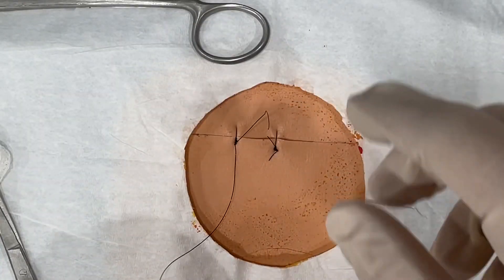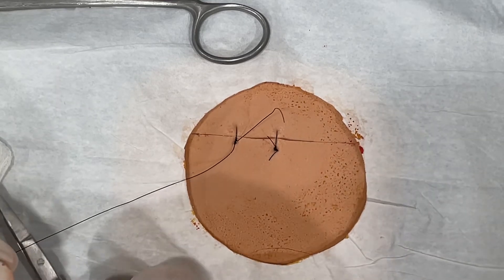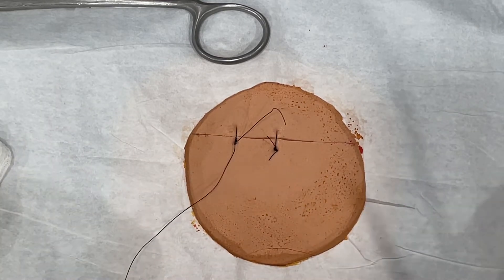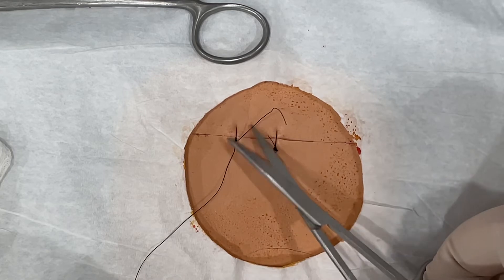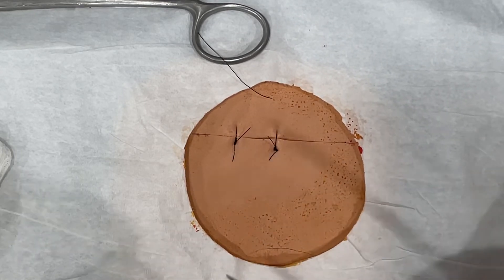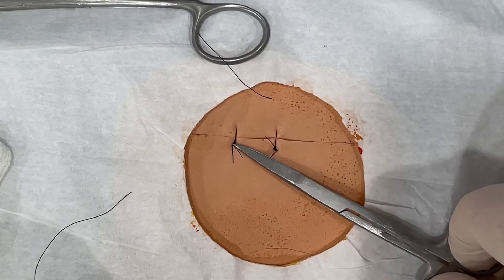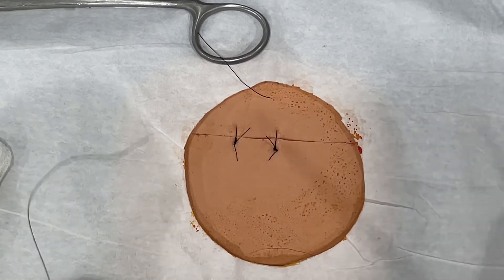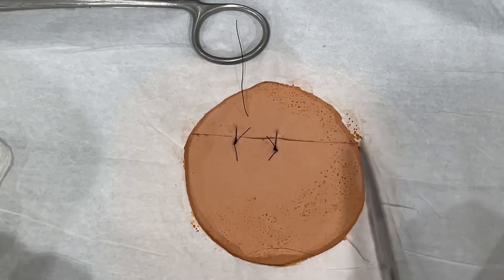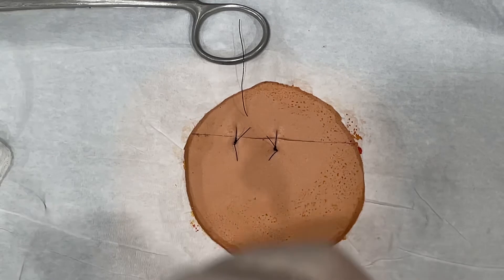What you want to do with the tightness of your suture — you don't want to strangulate, you just want to approximate. Bring those edges together and let the body do the rest. See how that suture knot is not over your laceration — it's over to the side. Repeat as many as you need.